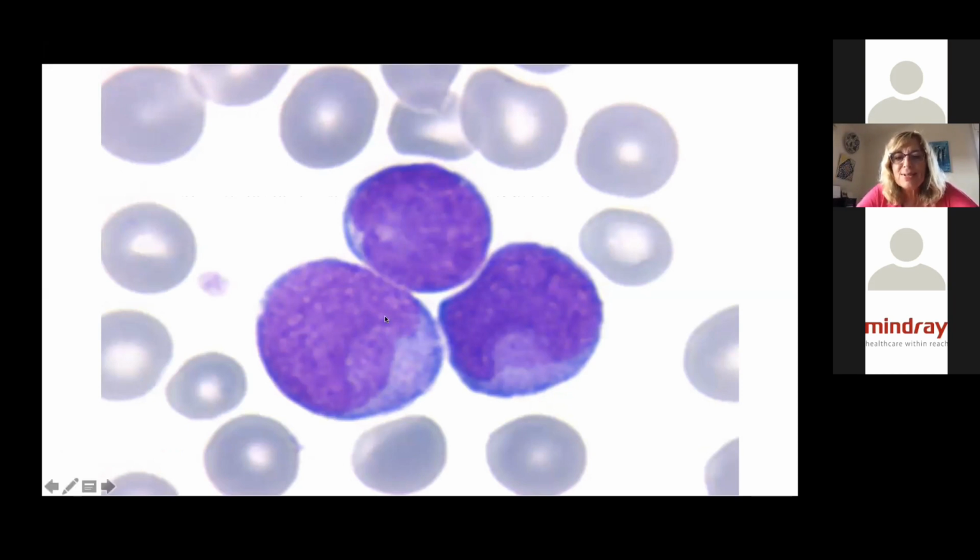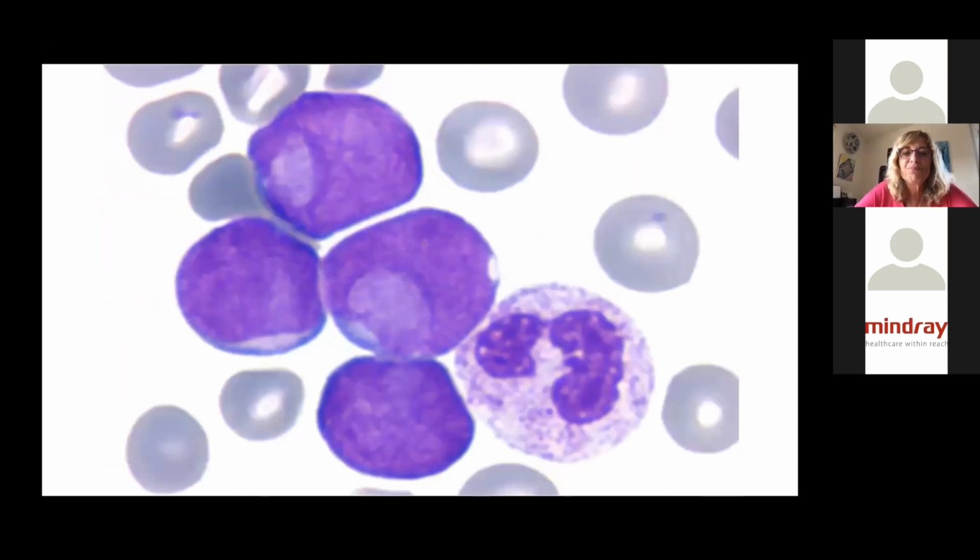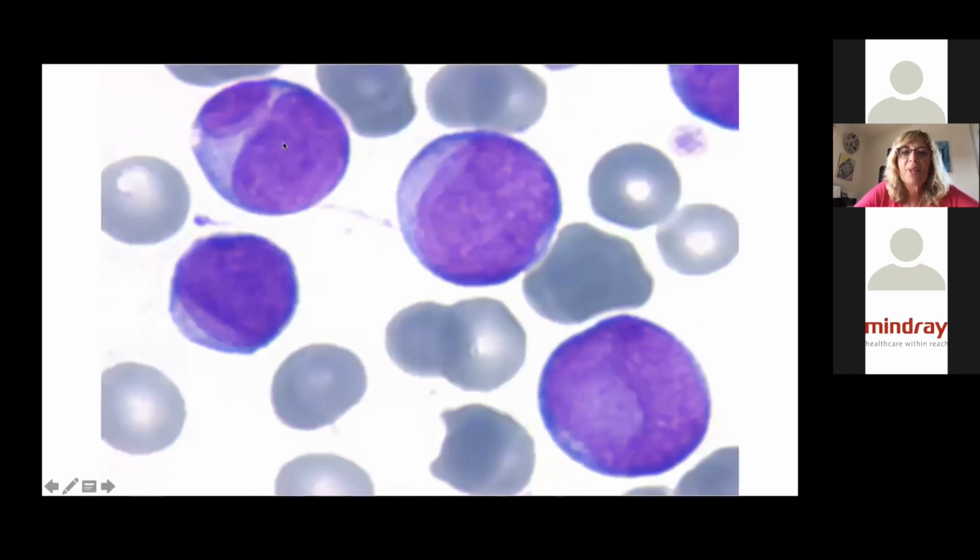In this case, you can see in the nucleus the cup-like morphological sign. We associate this morphology and this cup-like blast to the nucleophosmin mutation. So it's nice because there is a correlation between the morphology and the genetics. More blast cells with the cup-like nucleus. Here you have more. Some of them show a cleaved nucleus.